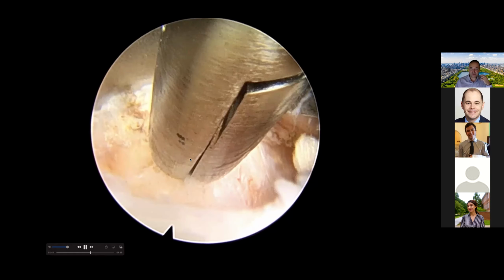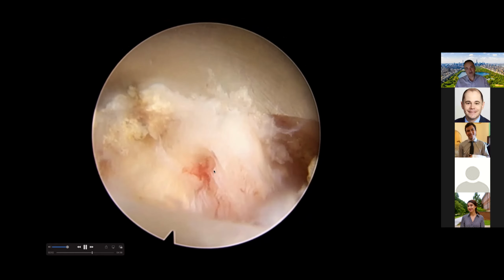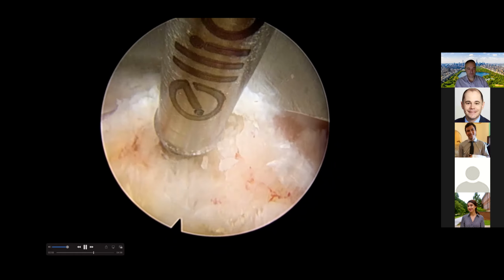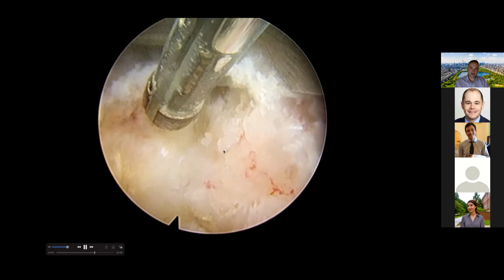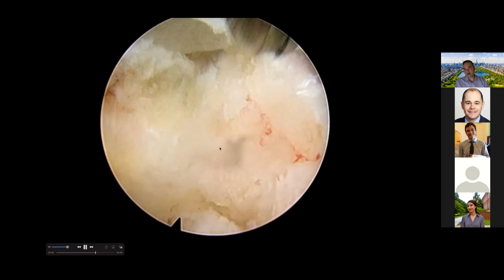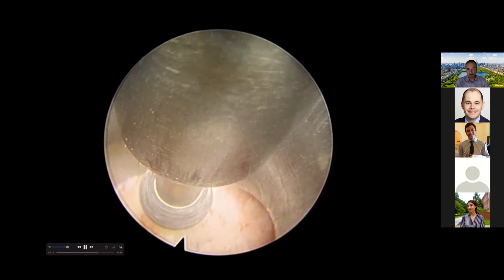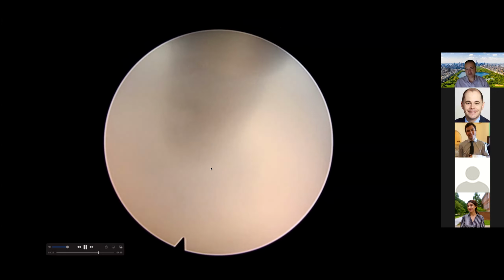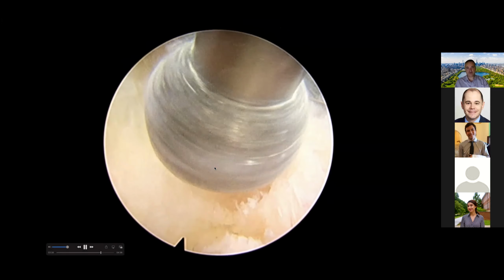So you see here, we're using the instruments, and there is a soft component that we can remove, but there's also a calcified component. You see that's calcified. And here, you're only looking, but surgery is, I would say, 50% palpation. We're using our hands and our sense of palpation to do many things. And here we're using the drill to remove that calcified disc herniation, because as you saw, we couldn't remove it with the usual instruments that we use for this purpose.